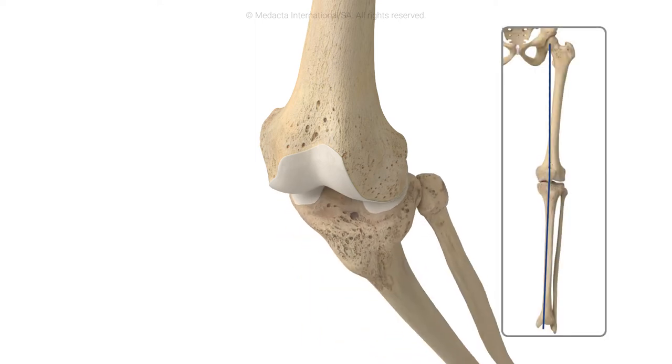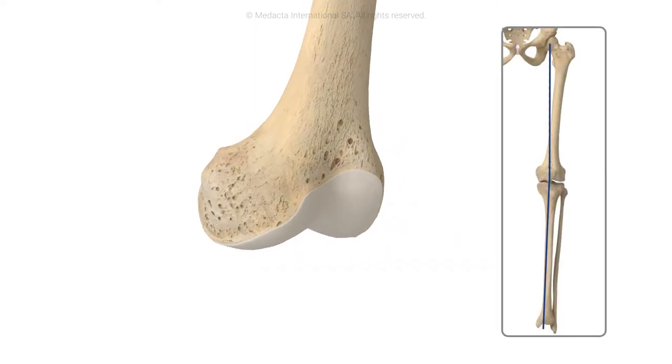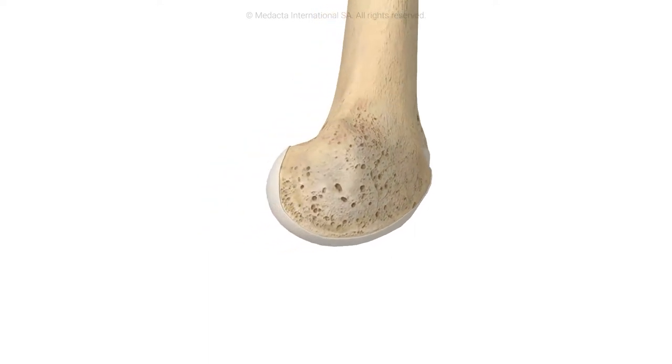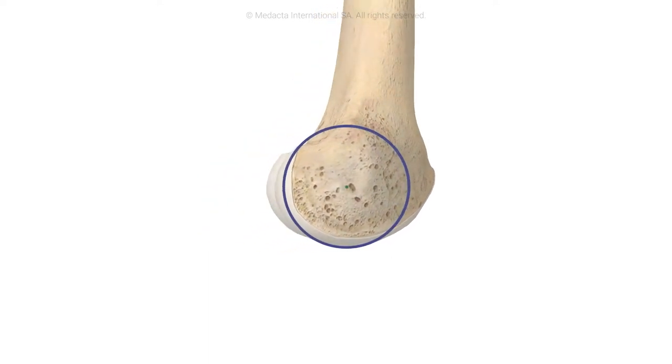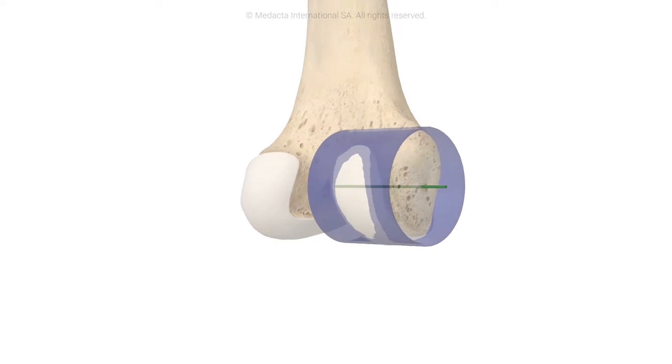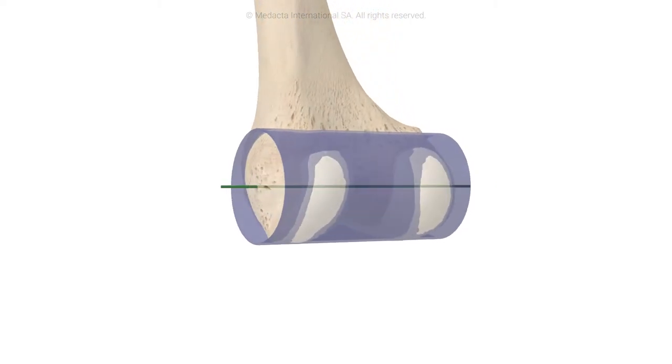Kinematic alignment originated from studies showing that the tibia moves about the femur in a flexion extension axis which corresponds to the axis of the cylinder that best fits the femoral condyles.